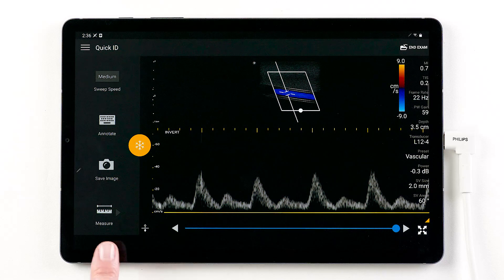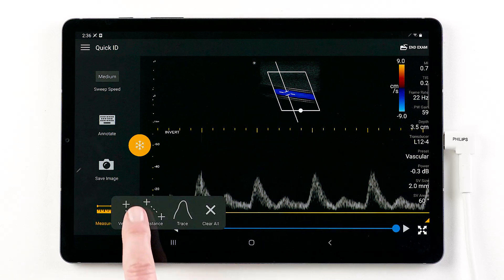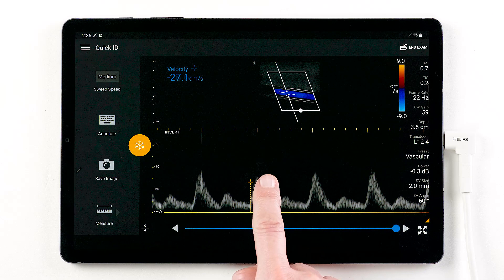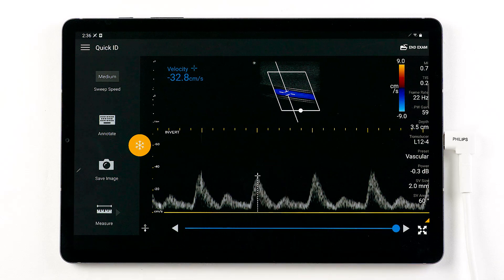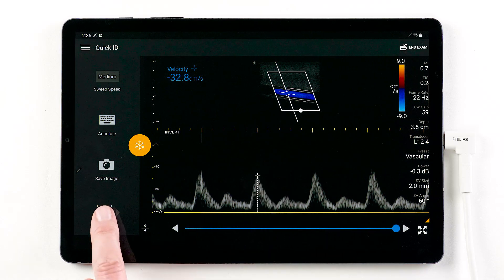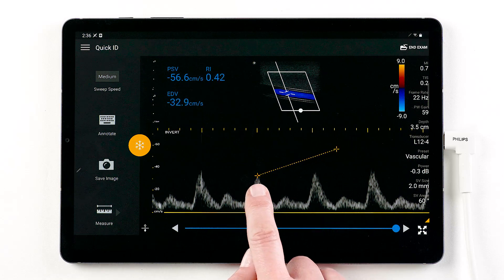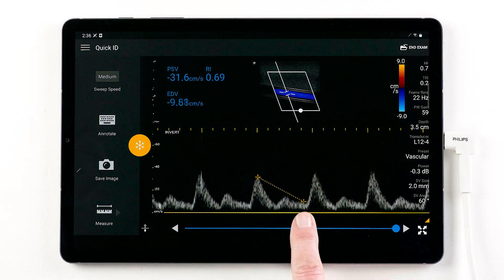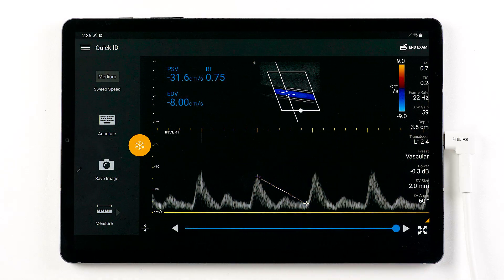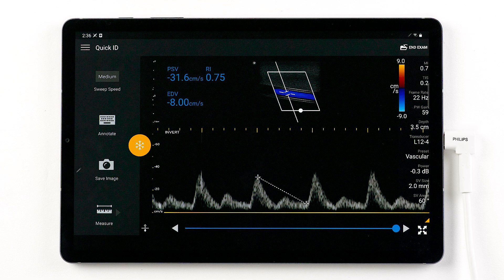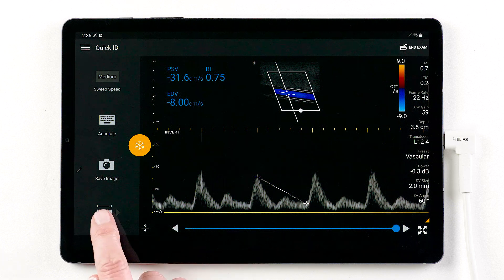Tap measure to access your measurement tools, which include single velocity, distance measurement, and a two-velocity caliper tool that allows you to measure two points on the waveform, like placing one caliper at peak systolic velocity, or PSV, and the other at end diastolic velocity, or EDV.